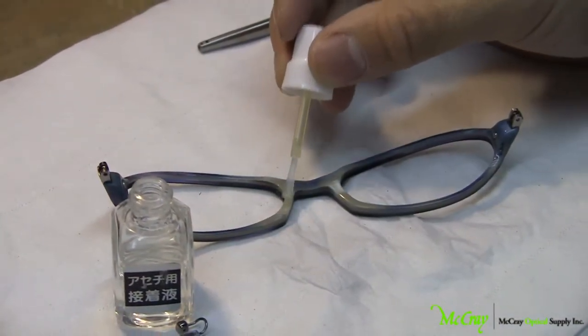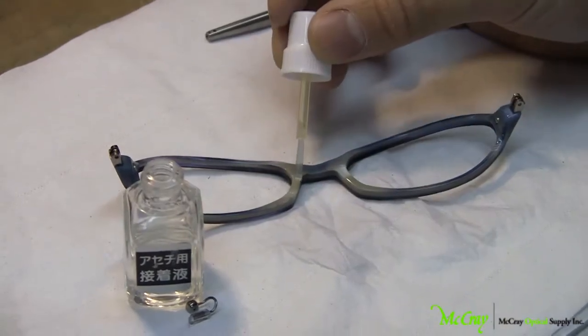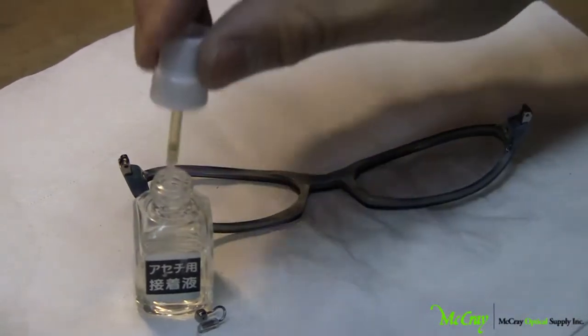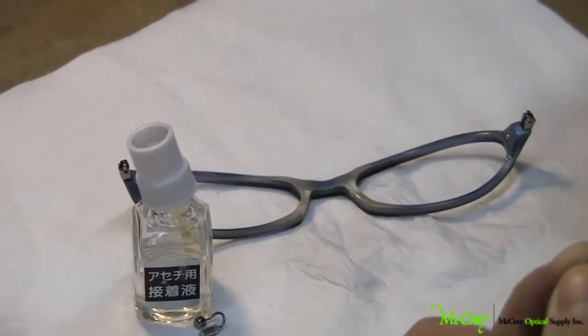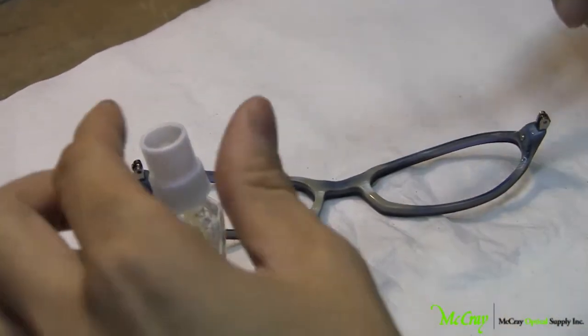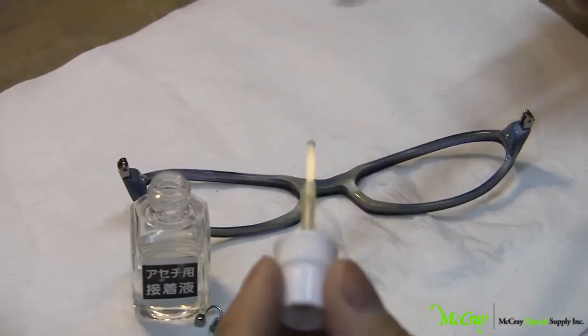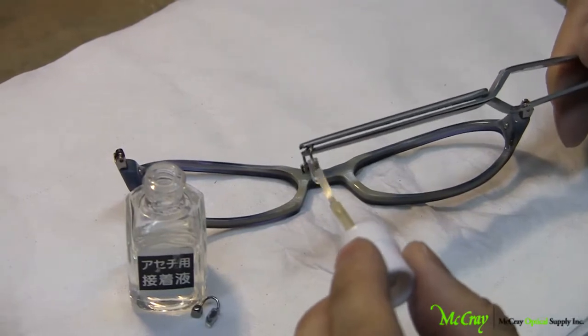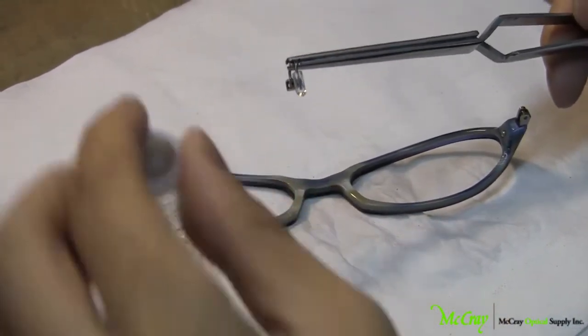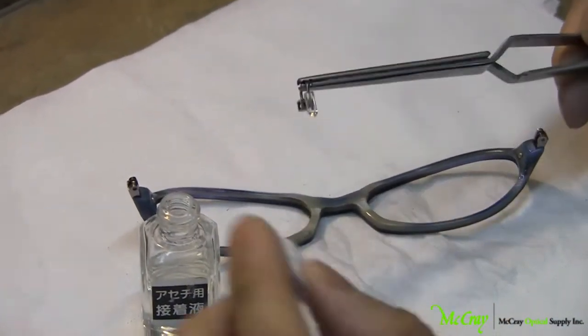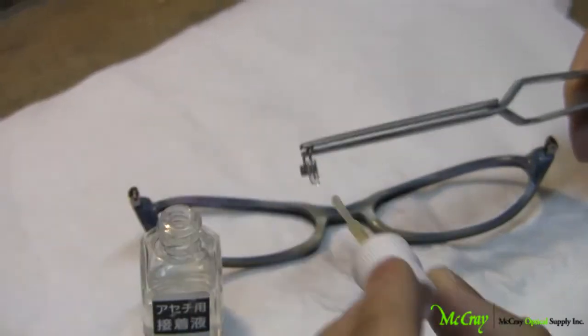This particular procedure will not work with optil frames. Again, optil frames is a different type of plastic, and the glue simply does not work with that type of material. Now, I'm going to apply the glue A to the titanium pad arm as well. And again, a generous amount.